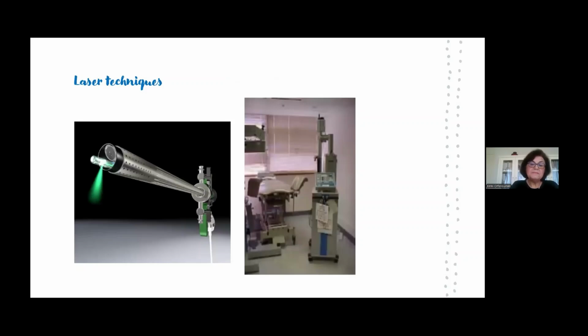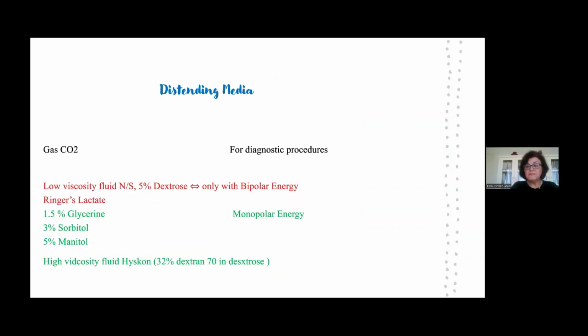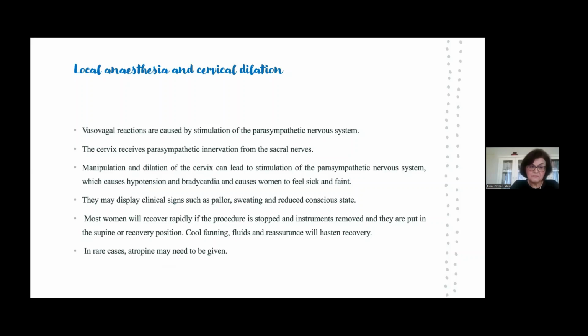Laser techniques. Distension media for office hysteroscopy. Gas CO2 for diagnostic procedures only. Low viscosity fluid, normal saline, 5% dextrose, Ringer's lactate, only with bipolar energy. 1.5% glycine, 3% sorbitol, 5% mannitol, high viscosity fluid Hyskon, only with monopolar energy.